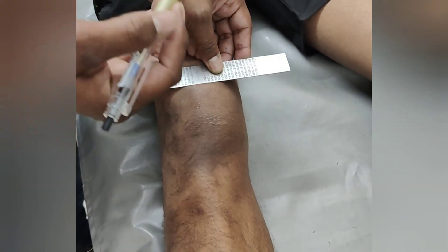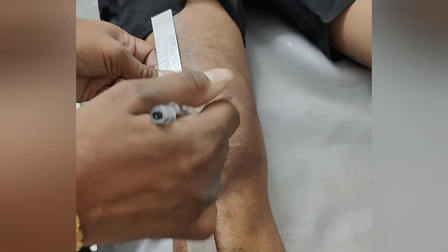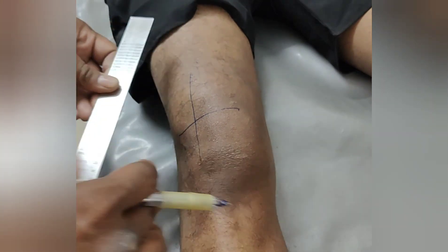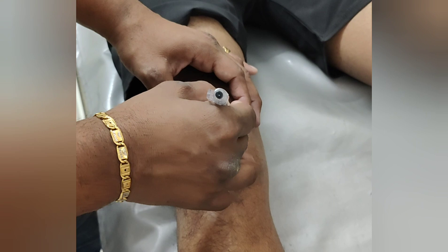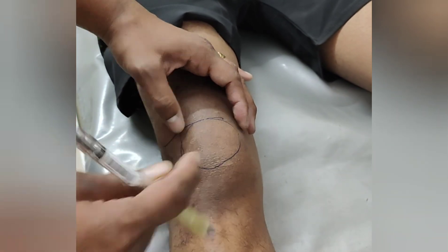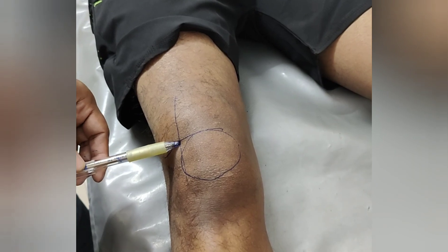Draw a line over the superior pole of the patella and another perpendicular line over the lateral border of the patella. Now I am marking the border of the patella. At the point where the two lines meet is the entry point for knee aspiration.